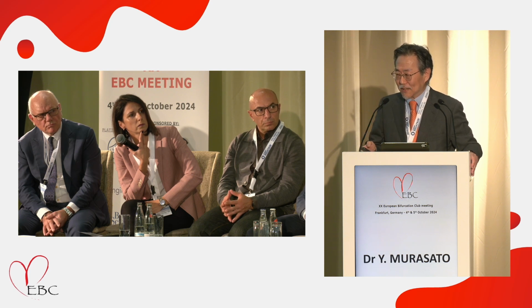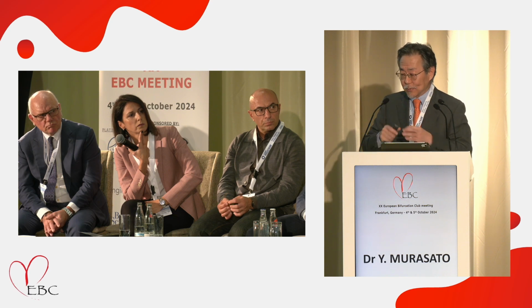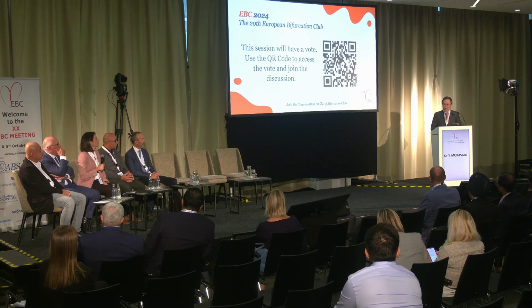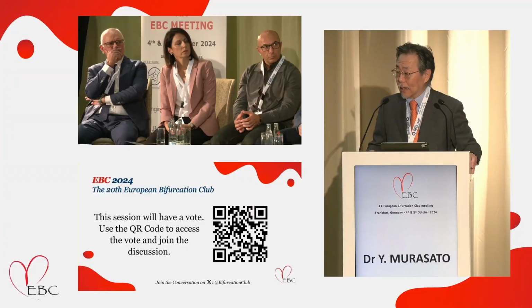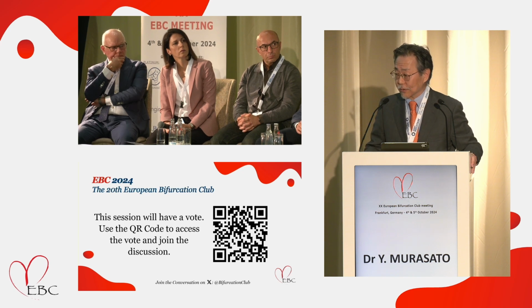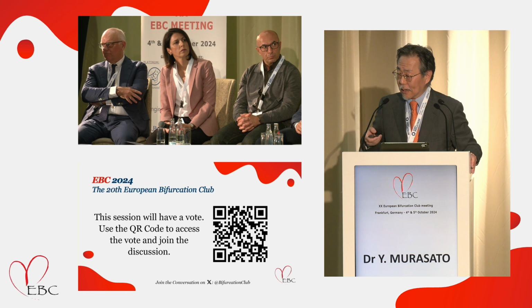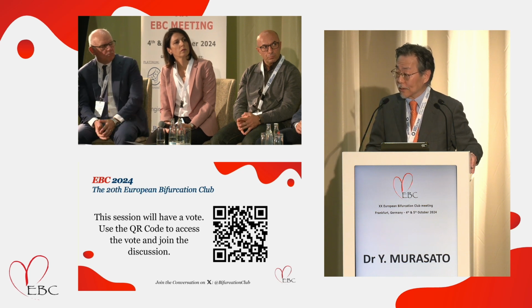In such a case, a cutting balloon or scoring balloon is not effective, and severe dissection occurred. So we treat that region with coronary atherectomy. Coronary atherectomy does not cause such serious dissection, so the pre-treatment with atherectomy is important, we think.